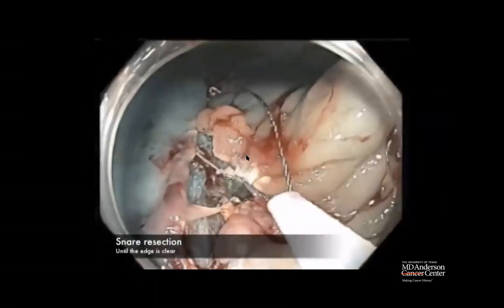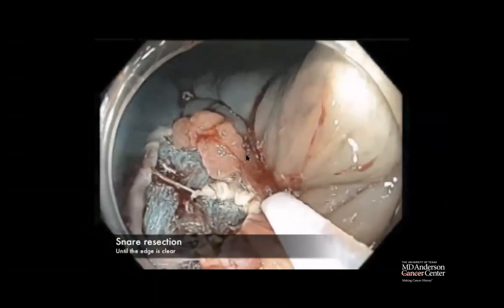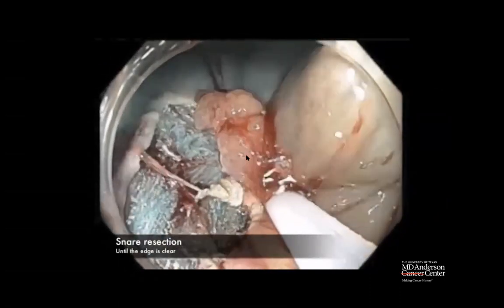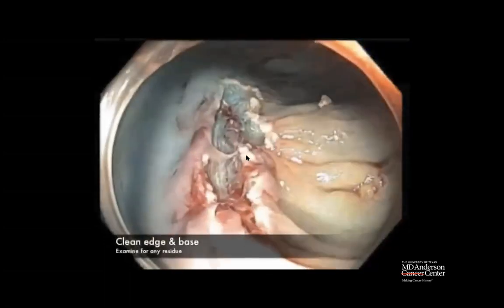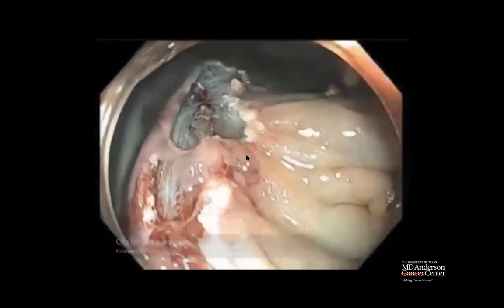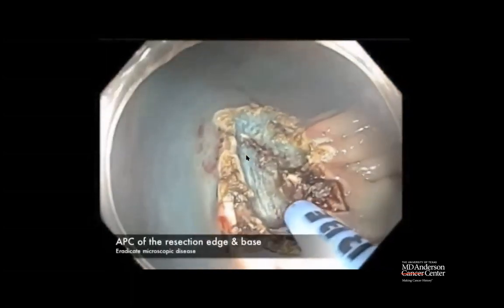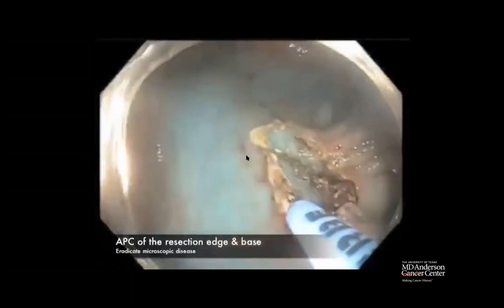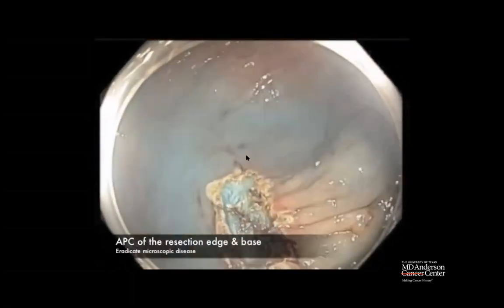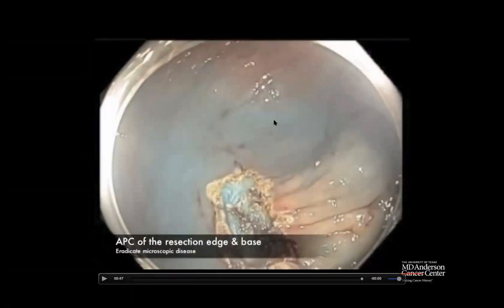If you applied the clip and you entrapped a little bit of a polyp in the clip deep into the submucosa, that polyp would come back and make it very hard for you to ensure a complete eradication of the polyp. Like every other case, we apply APC at the edge to prevent a delayed recurrence.